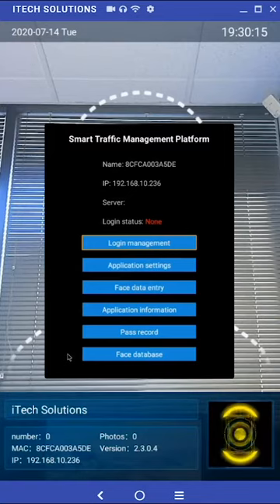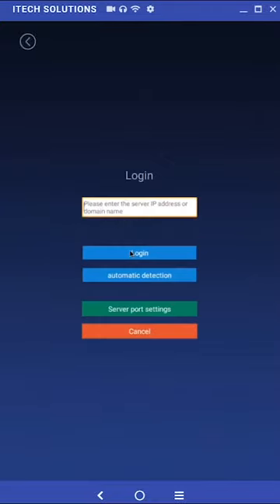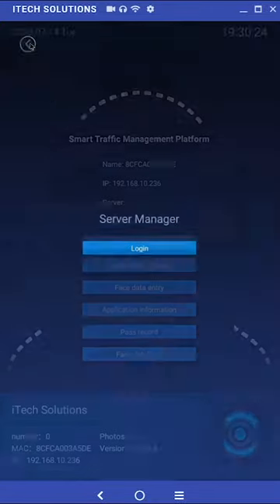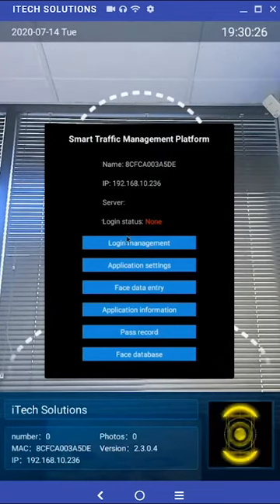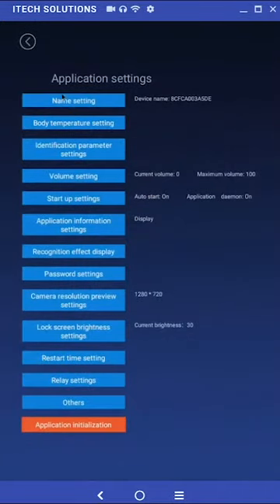Login management contains settings to manage the unit using software on the server. This information will be covered in the advanced settings video. Application settings will be addressed in more depth later in this video.